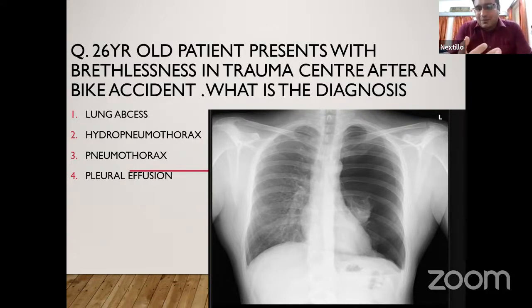Should I wait for your answer? Come on. Mudit Soni, yes, opacity is a denser material. Anuj Sharma, air. Yes, the lung is replaced by air, so it is appearing black. And when the lung is replaced by air, the pleural cavity is filled with air. So it is appearing black, as more X-ray is penetrating, more X-ray is reaching the film. So what will be the diagnosis?